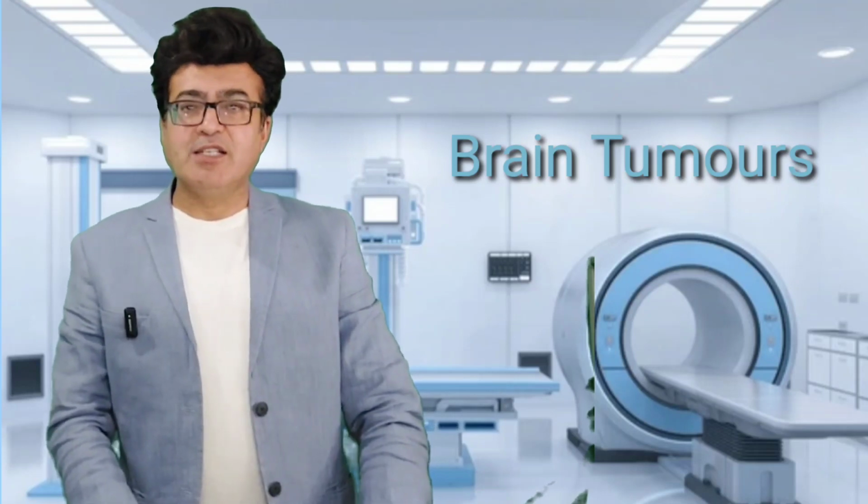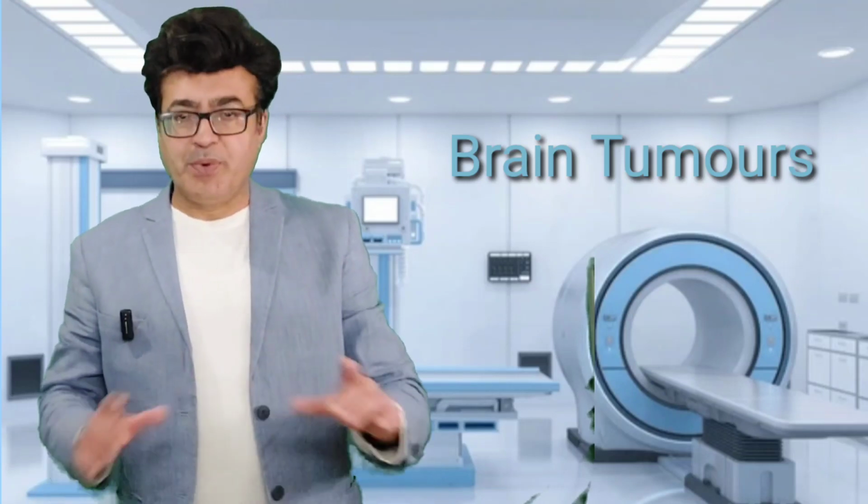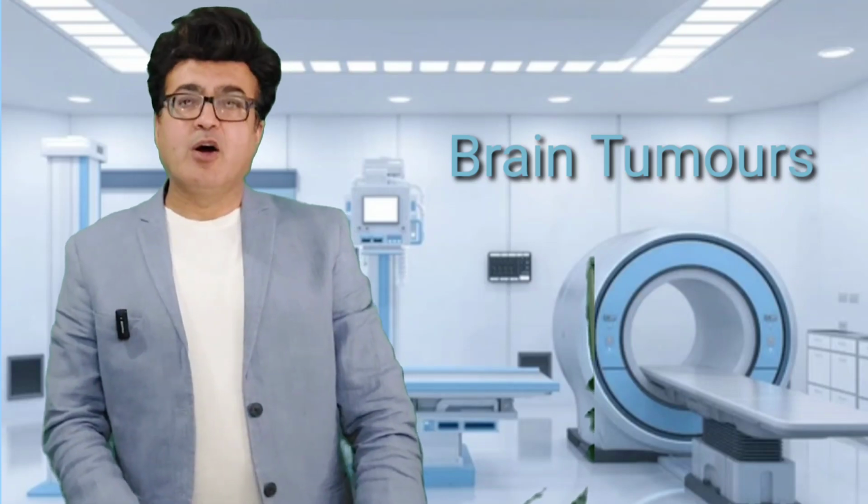Intracranial tumors are divided into two main categories. These are intraaxial tumor and extraaxial tumor. Intraaxial tumors are also called glioma. It's a big category, and it includes astrocytoma, oligodendroglioma, and also ependymoma.